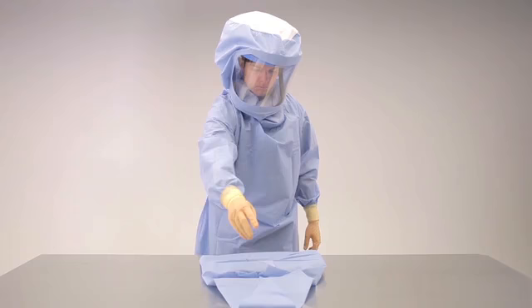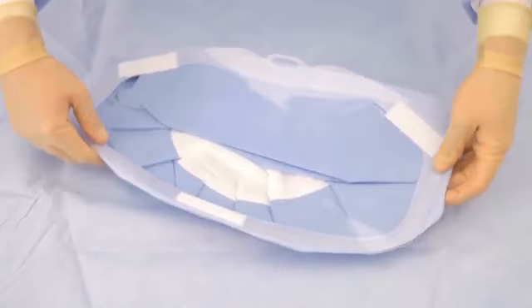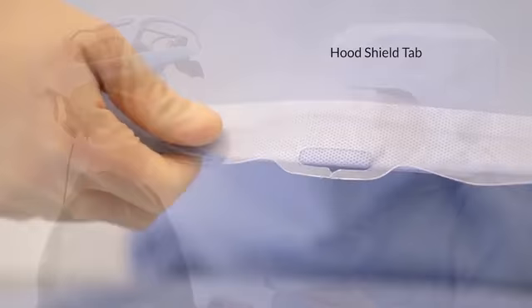Peel open the hood package and transfer the sterile wrapped hood into a sterile field. Orient the hood with the inside of the face shield on top and identify the tab on the bottom of the hood shield.